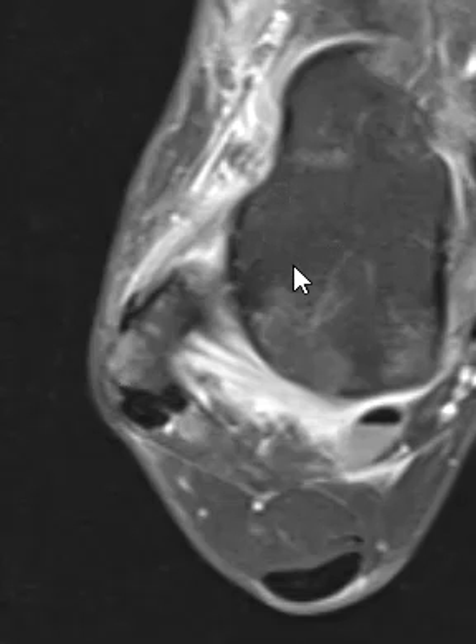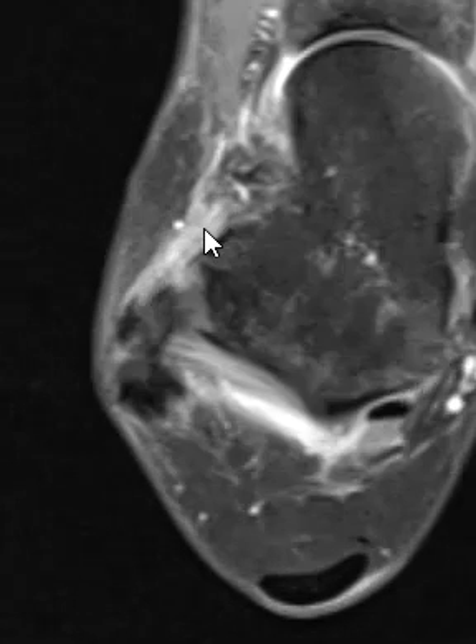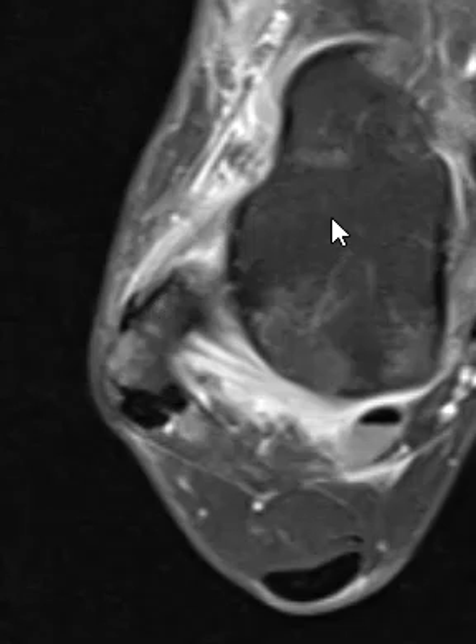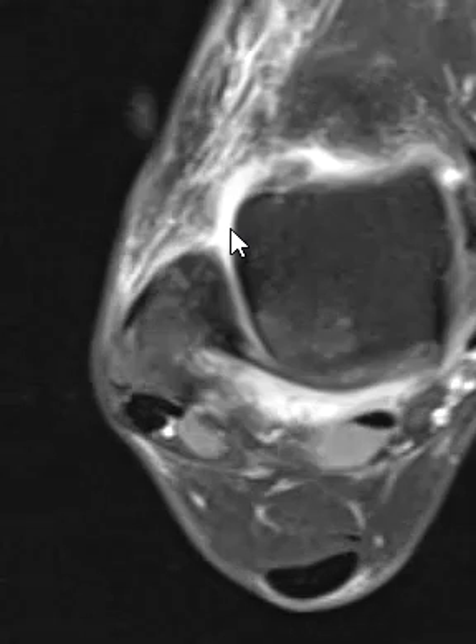This is the talus, which is below the ankle joint, and there's a ligament here. This is the one most commonly torn, called the anterior talofibular ligament — just like it should be named, talofibular. Normally it should be a nice, well-defined black band, but instead this is foggy and thickened and irregular. So this is a high-grade sprain of this anterior talofibular ligament.